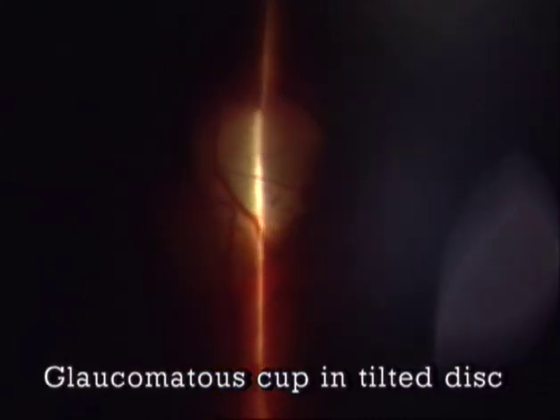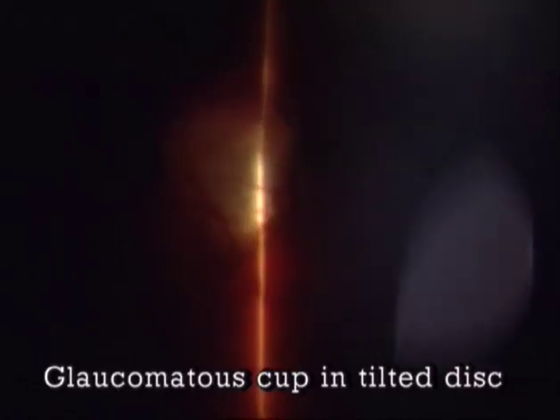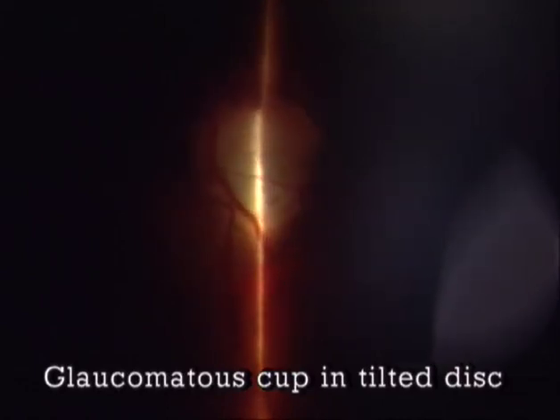Here the narrow slit is in focus at the upper slightly prominent margin of the disc. The slit becomes wider at the cup and at the inferior crescent of the disc, and it is narrow again at the retinal level.